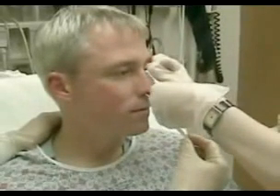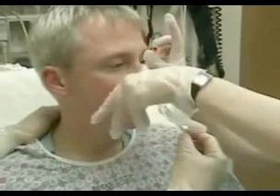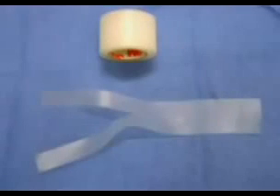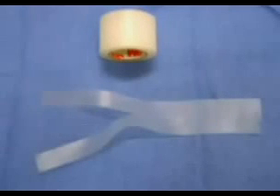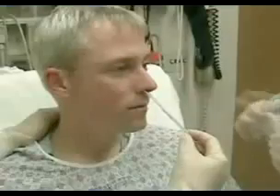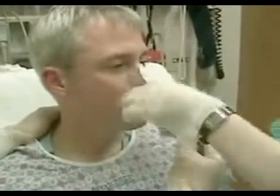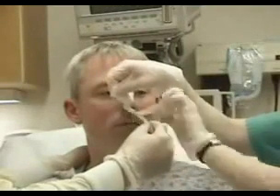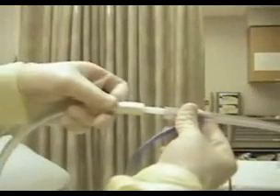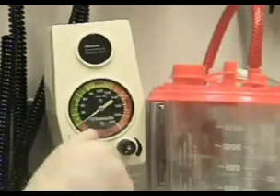The tube should be secured to the patient prior to transport to the radiology suite. Take a 5 to 7 cm strip of adhesive tape and tear it vertically for one half of its length. The wide section is placed across the patient's nose and the two tails are then wrapped in opposite directions around the NG tube. You may now connect the nasogastric tube to suction and adjust the vacuum force as desired.